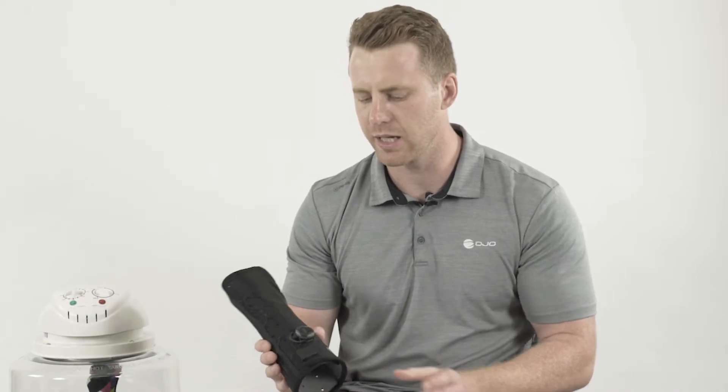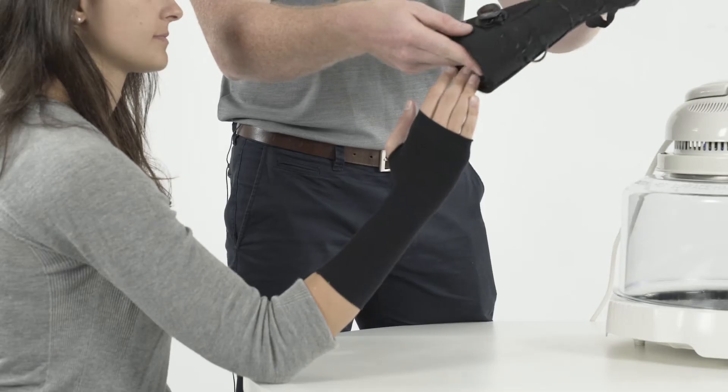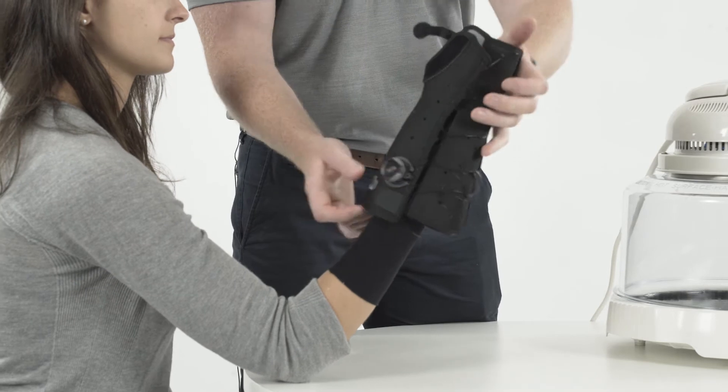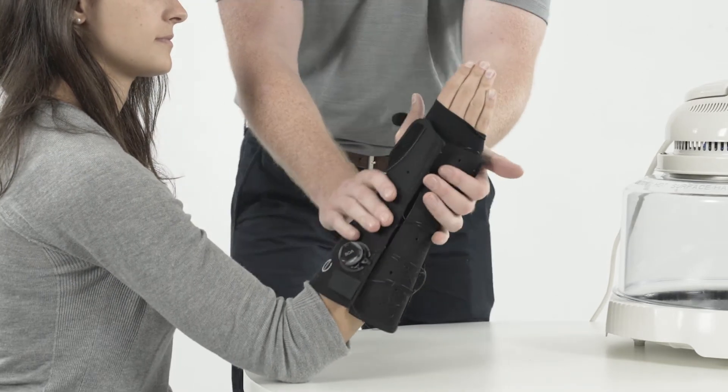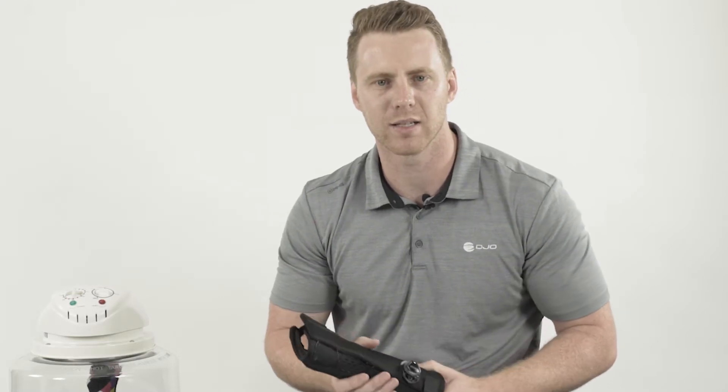In addition to the lock ring kit accessory, you can also purchase an Exos undergarment or under-sleeve that goes under the brace. This is really nice for patients with more sensitive skin and is widely used by many of our clinicians.